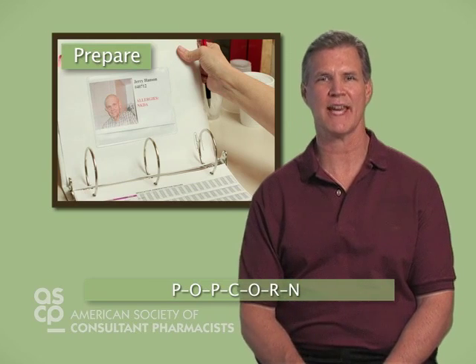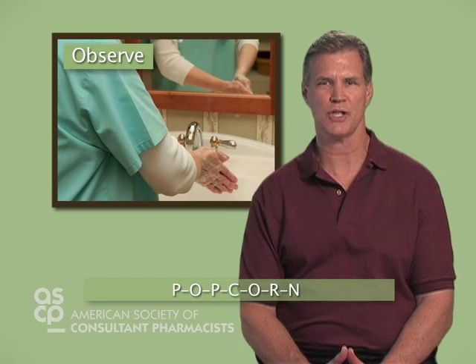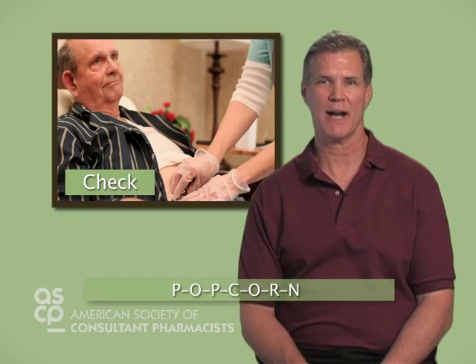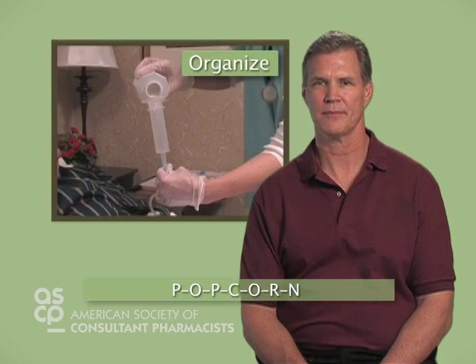Prepare the resident and setting by obtaining medication parameters, assessing for pain, and gathering supplies needed for the procedure. Observe hand hygiene practices by washing hands. Perform the 5 right triple check system while preparing each medication. Check for positive gastric placement according to facility policy.